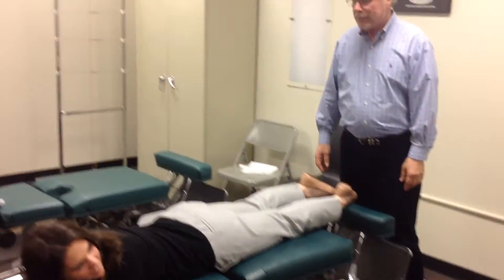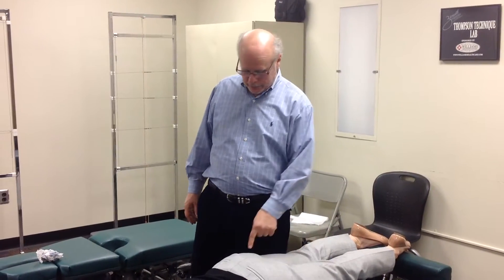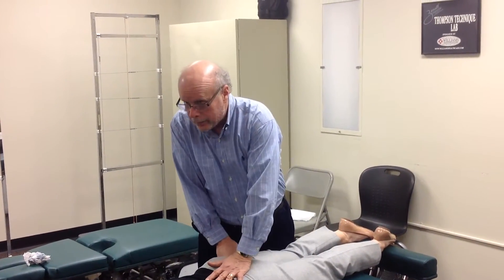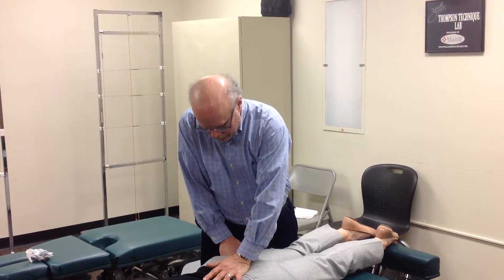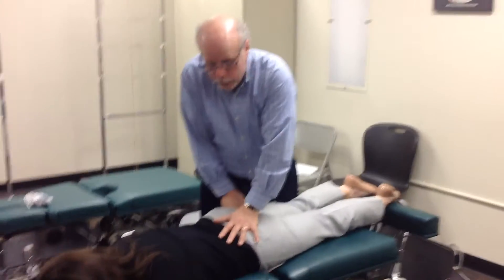We did the negative Deerfield. The PI ilium is just the opposite. If she had a PI ilium here, she'd have a positive Deerfield with leg lag. I would stabilize the right ischium with my right fist, contact the left PSIS, and thrust inferior to superior, posterior to anterior with this hand — table drops.